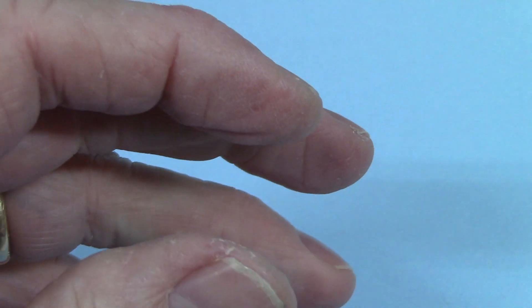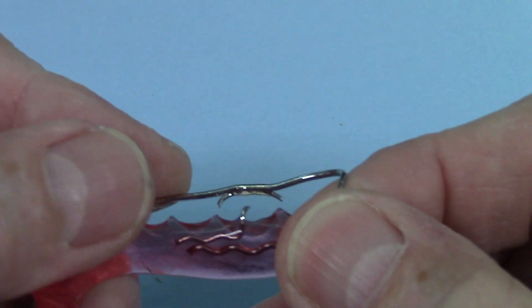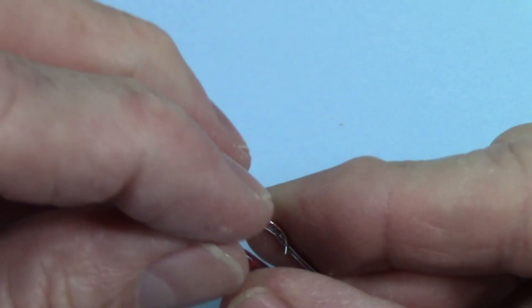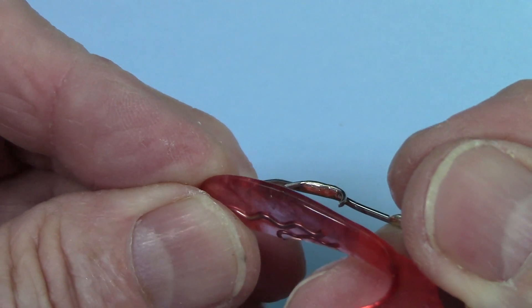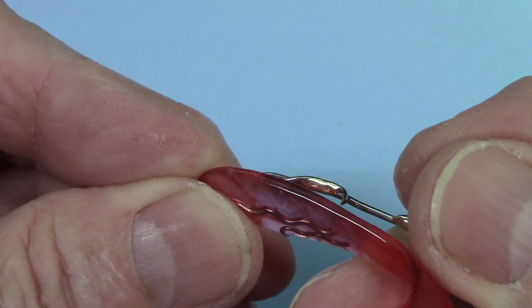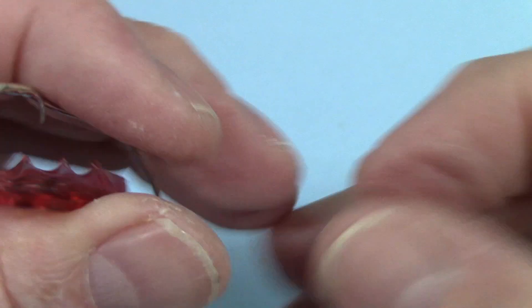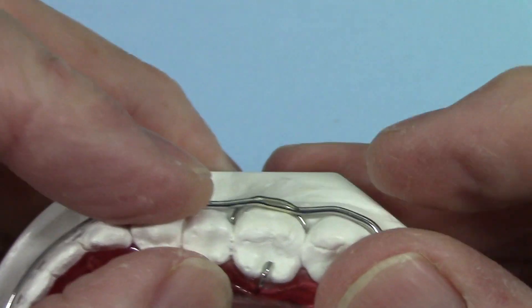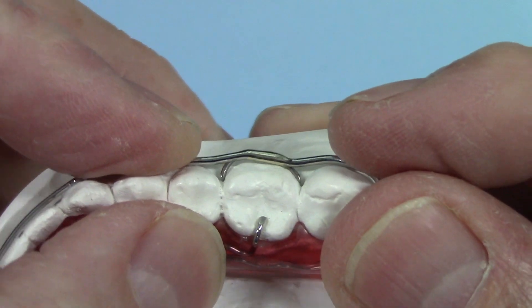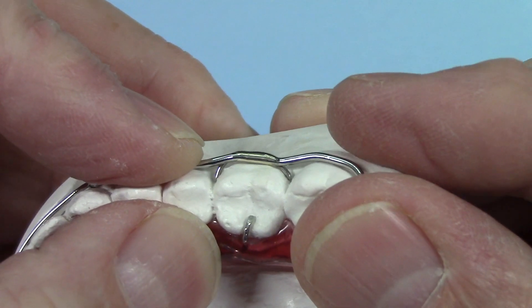Here's one where it's a retainer — another way you can use the Crozat clasp. This one I did not use the band material, but I left the wires away, and you can see it's still a pretty good solder joint. It's not as good as the one with the band, but it's still not bad. I used the clasp on this labial bow, so it gives it some retentive value in the mesial-distal embrasures.